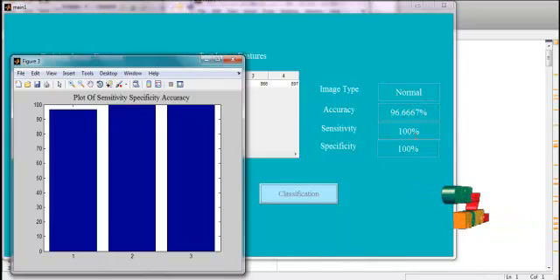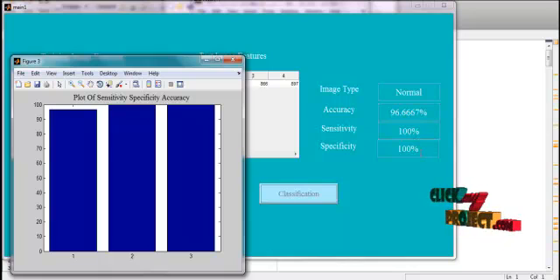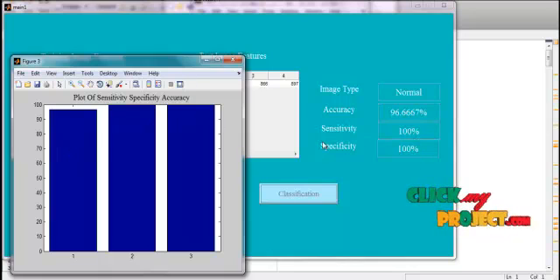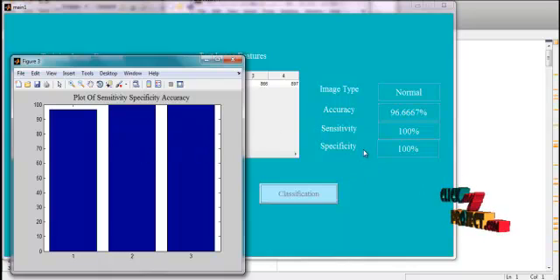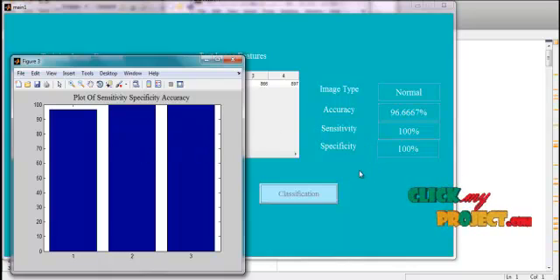Accuracy, sensitivity, and specificity values were measured, and the obtained values were plotted as a graph. We are using a probabilistic neural network classifier for this.